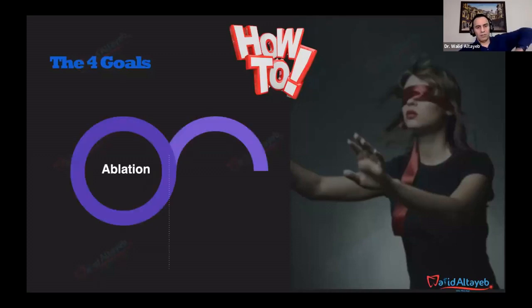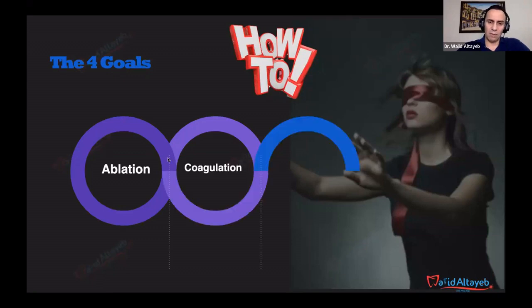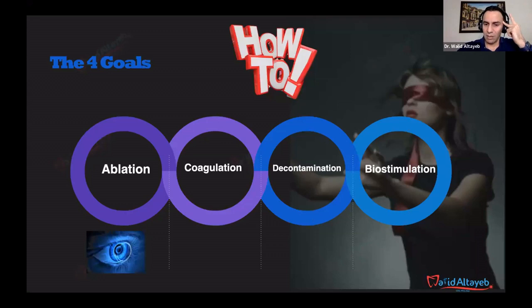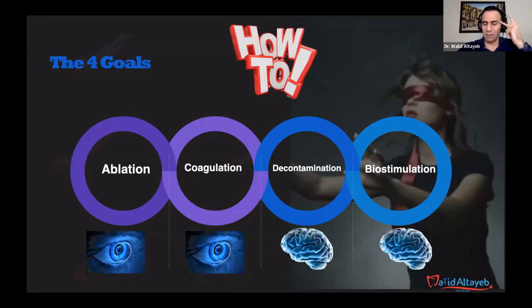Again, at the end of this presentation, just remember two things about what's important with the laser. The laser can achieve the cutting that the blade can do, but with laser you have the coagulation, and this is something you see with your eyes. But the laser also adds another benefit that you can't see with your eyes, but is utilized in follow-up. With the decontamination of the laser procedure, in most cases we don't need antibiotic. We control the bacteria in this area. And the most important thing, the biostimulation: the healing process will be faster and the discomfort after the laser procedure will be less.